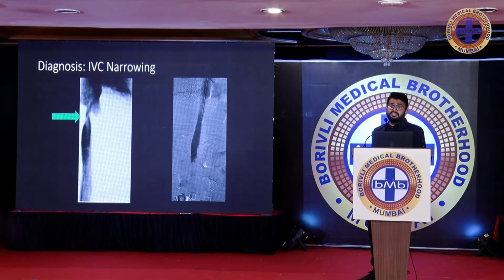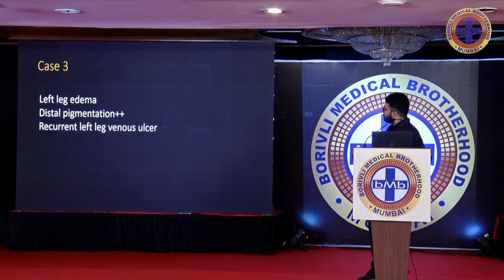Imagine if we had gone ahead and just ablated the lower limb varicosities in this case, and that would have aggravated the lower limb venous congestion.